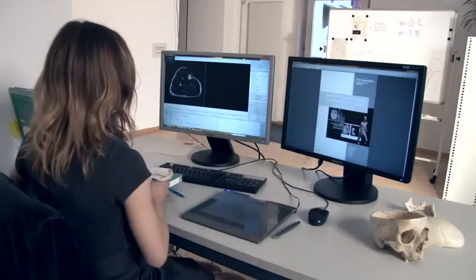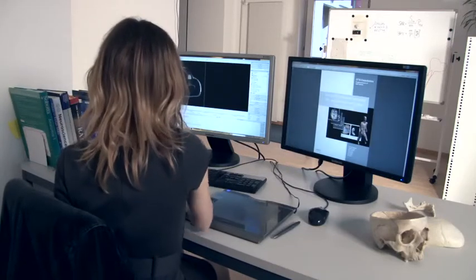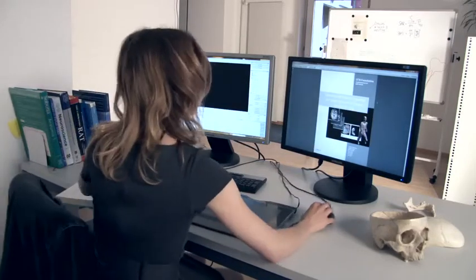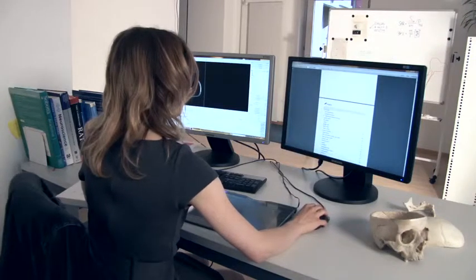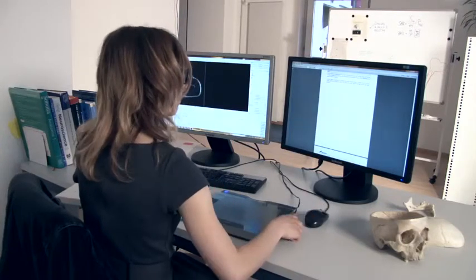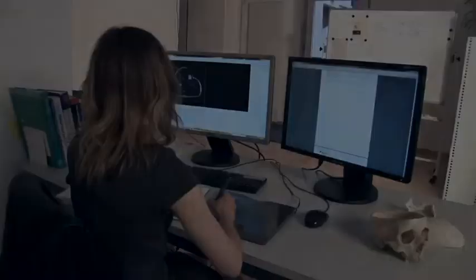Prior to the segmentation of a tissue, we consider our internal guidelines, containing information about how every anatomical structure has to be segmented. We have also defined the structures, for example, certain blood vessels that are mandatory. These guidelines ensure that the differences between our models reflect actual anatomical differences between the scanned volunteers.